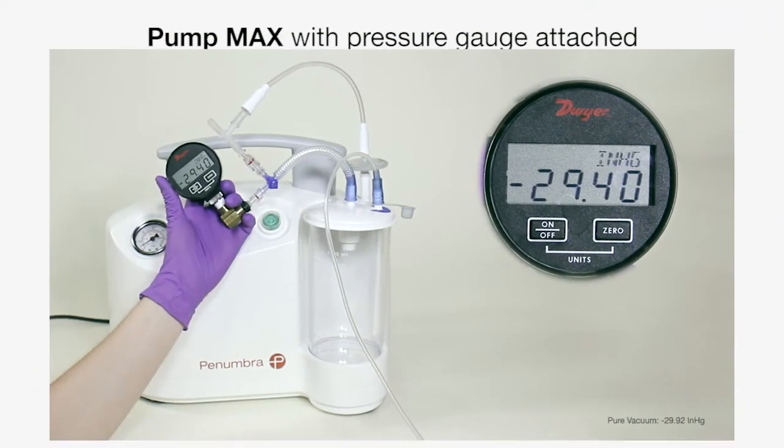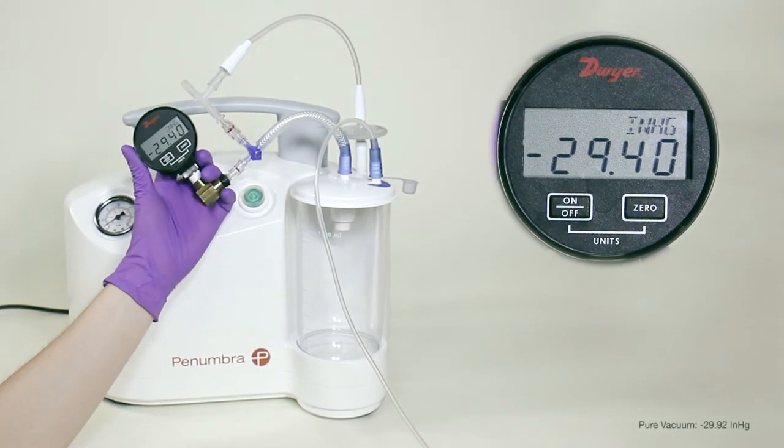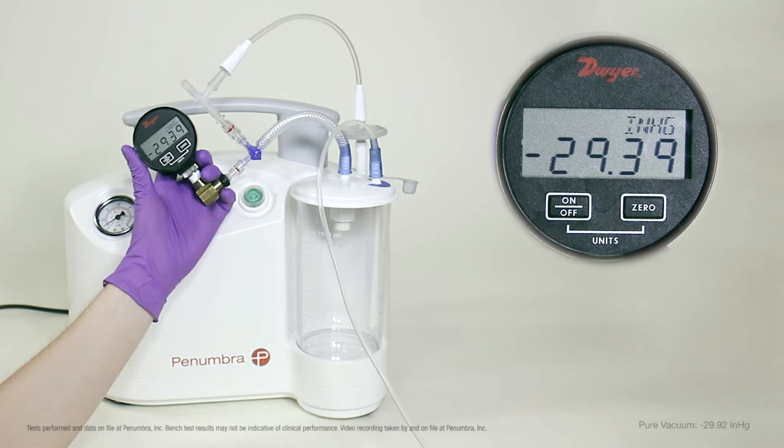Here we attach a pressure gauge to the PumpMax. For the test, we will attach a CAT-RX aspiration catheter to PumpMax via aspiration tubing, with the distal portion of the CAT-RX submerged in water.